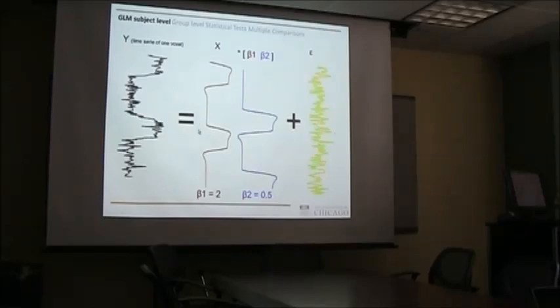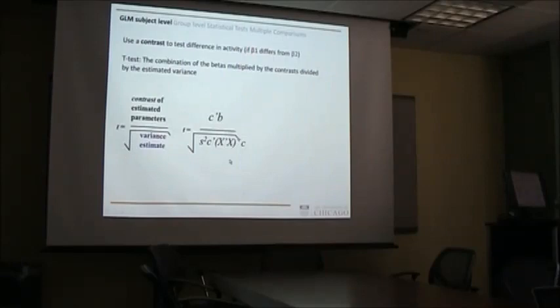Again, this is just a visualization. The mathematical background is quite different actually, and you're not really doing this; you're doing this whole model testing in one go. But this might be a way to think about it. So you've now established how well the model and each part of the model fits the time series. And what you then might want to do is test whether the model, and which part of the model, fits your observations better.